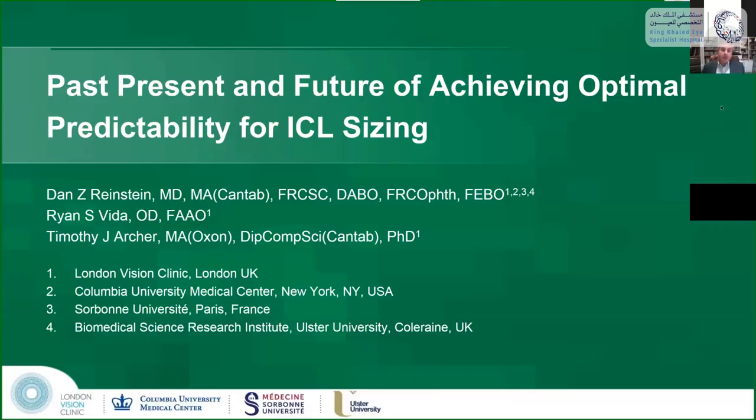It's just the outliers. And it's the outliers which cause this rather unpleasant exchange surgery, which is not a pleasant experience for either the patient or the surgeon. And it certainly means more sacrifice to endothelial cells. And it's just something we'd like to try and avoid.